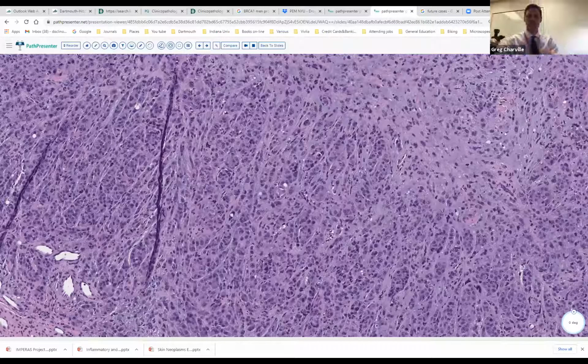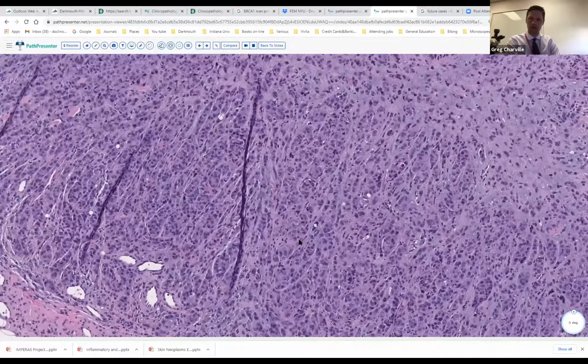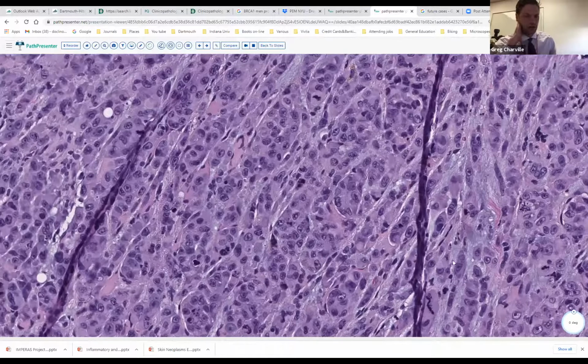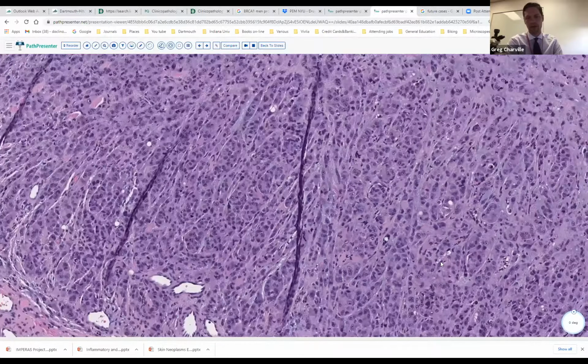Yeah, that differential sounds great. I also felt like some of those intracytoplasmic vacuoles did have a hint of vascular lumina. I wasn't sure if there were red blood cells in some of them, and then I also thought extraskeletal myxoid chondrosarcoma, and you know we have used INSM1 here, and that in our hands seems to be quite a good immunohistochemical marker to use in that context.